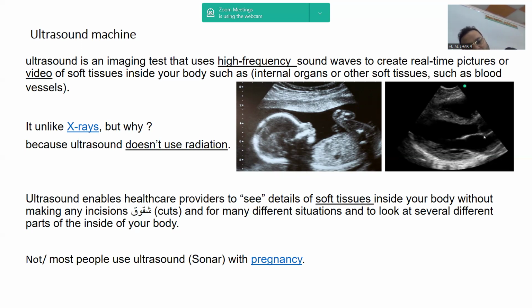And let us not forget, it's very commonly used with pregnancy to take images at different times as your baby develops, from the first few months until before he or she is born.